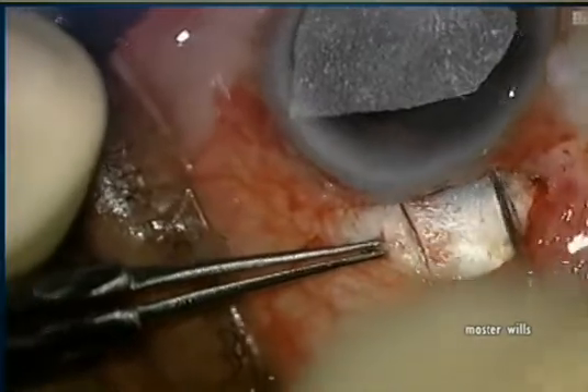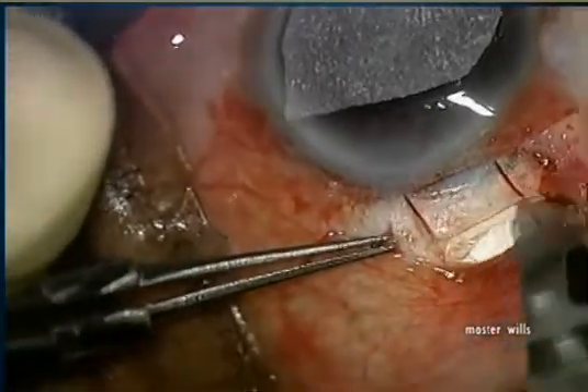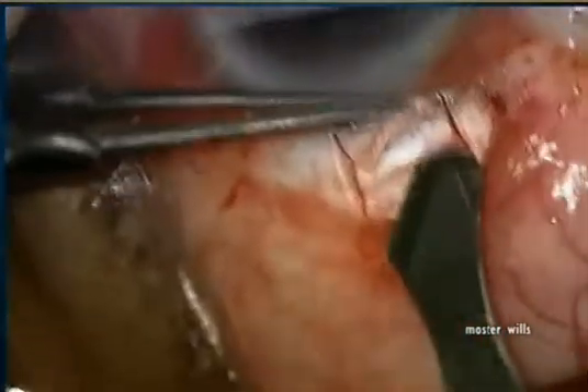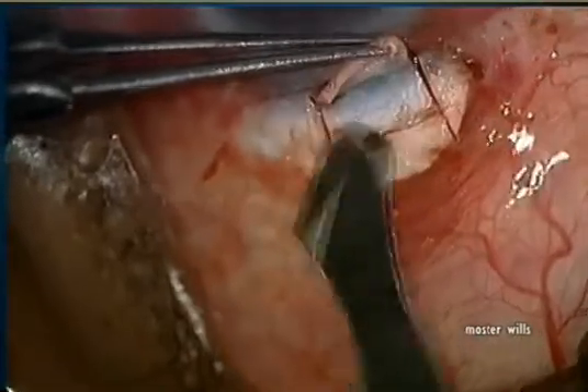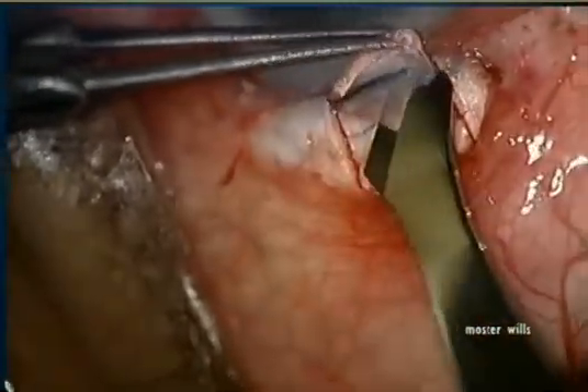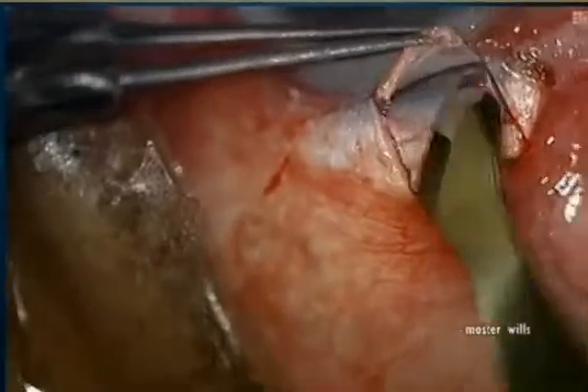We're making a rectangular flap with a 67 blade followed by a 57 blade into clear cornea. It's very important that when you make your flap you try to make it at least half thickness and clear it right into the cornea so you're able to see the anatomy well.